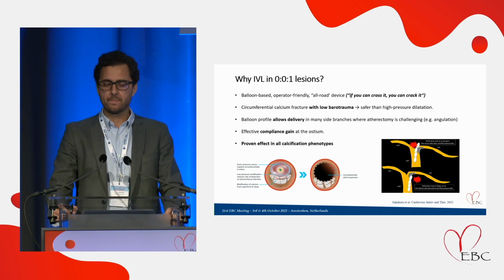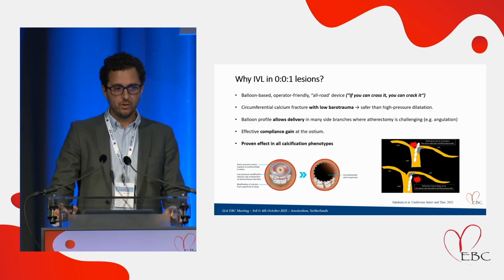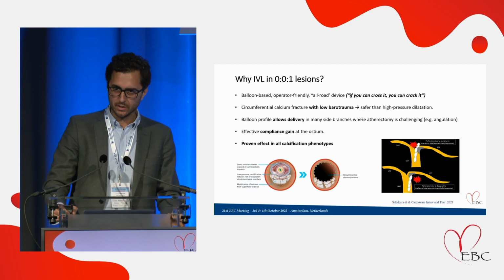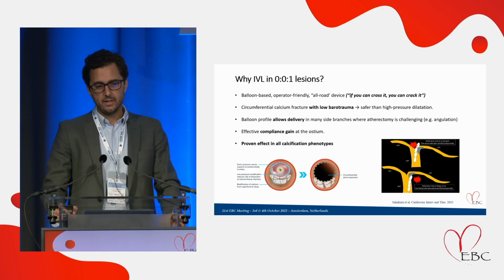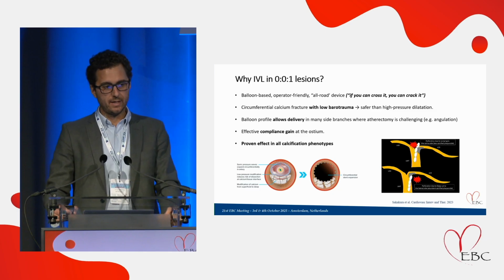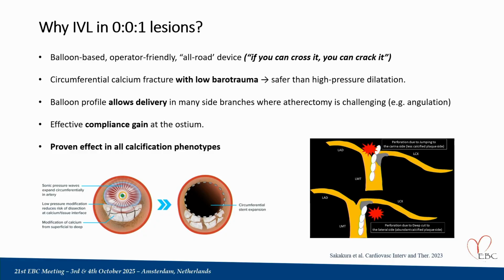The balloon profile allows delivery in many side branches where atherectomy devices are challenging, for example with angulation. We also know that when dealing with a calcified ostium, like an ostial circumflex, we can easily generate perforation when the calcification is really marked. We can generate effective compliance gain at the ostium, and the effectiveness, as I said, has been proven in all different scenarios. Even when confronting eccentric calcification and even nodular calcification, Shockwave is able to generate fractures at low pressure on the calcification that we are facing.